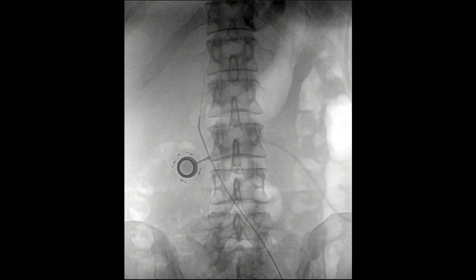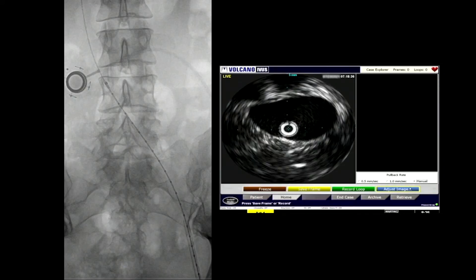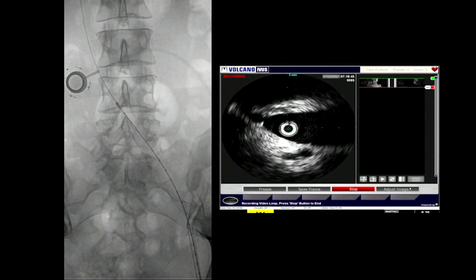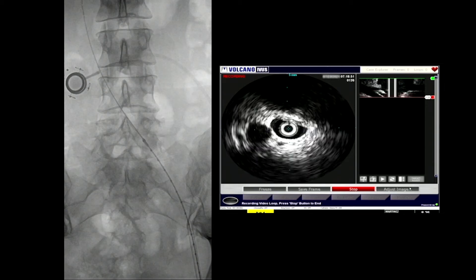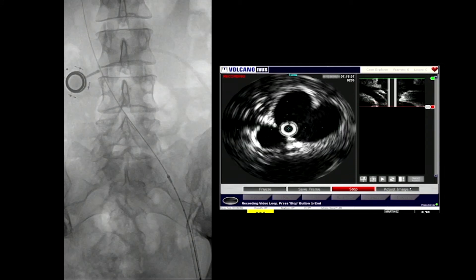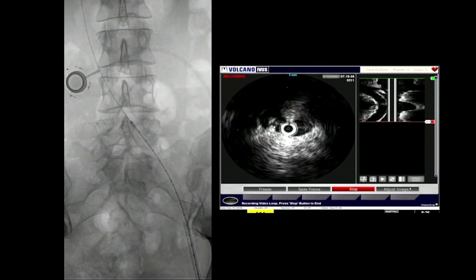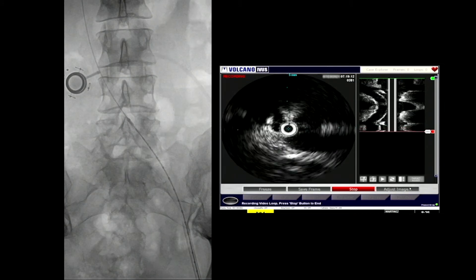We then tilted the table so there was some reverse Trendelenburg. Once in that position, we got the catheter in the renal vein — there was no evidence of significant reflux. At that point we came back down and performed an intravascular ultrasound. You can see there's almost complete obliteration of the left iliac vein as it's compressed behind the iliac artery. We can also mark this on the screen — you can see the IVUS catheter going backwards and forwards, confirming the confluence of the iliac veins and the inferior vena cava.